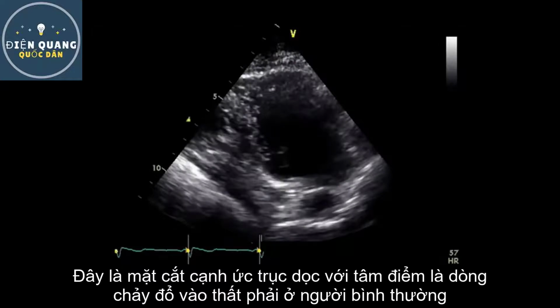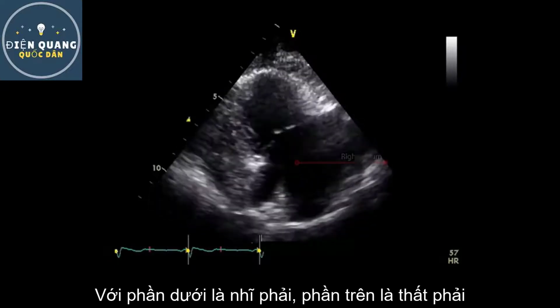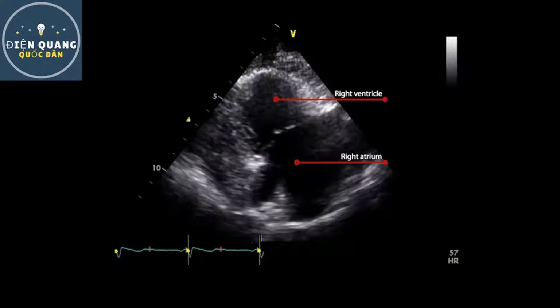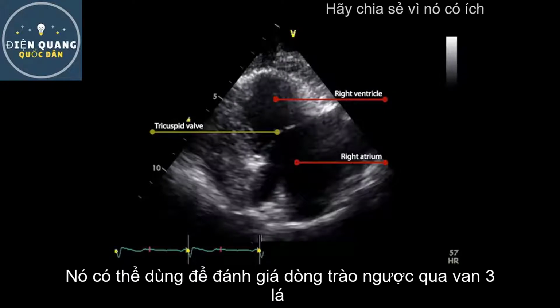This is a parasternal long-axis view of the right ventricular inflow tract of a normal heart, which shows the inferior portion of the right atrium and the inferior and anterior right ventricular walls. This view is useful to visualize the tricuspid valve and its anterior and posterior leaflets. It can be used for the calculation of the tricuspid regurgitant velocity in patients with an eccentric tricuspid regurgitant jet.